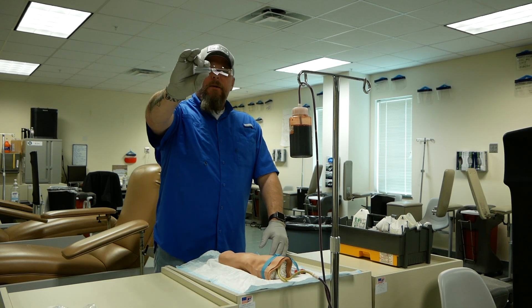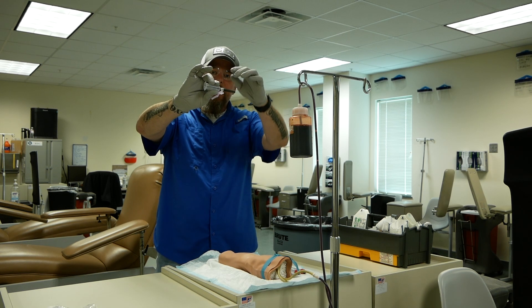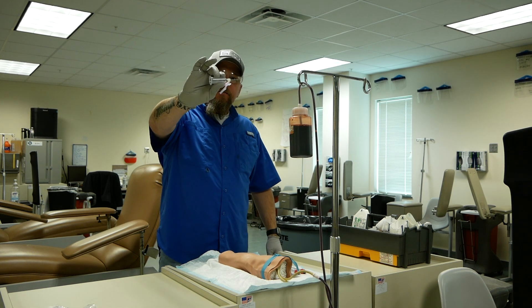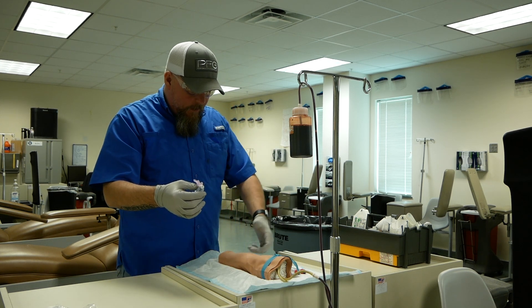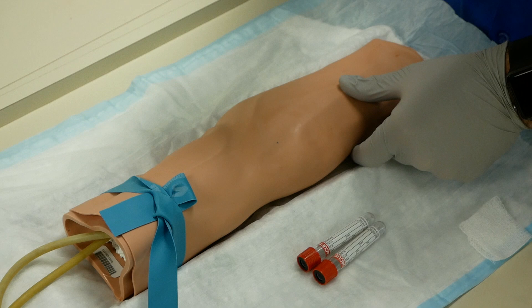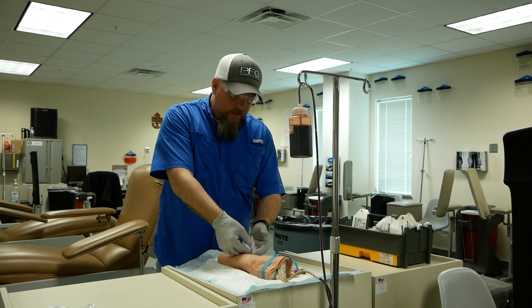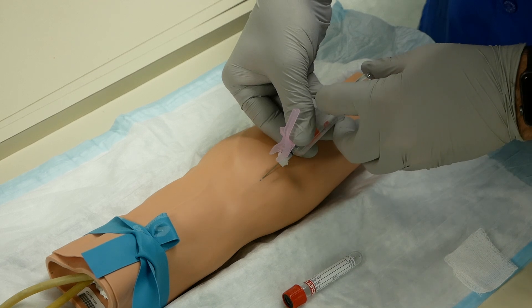Pick up your vacutainer holder with your dominant hand, pink safety cap on the bottom this time. Take your non-dominant hand and pull your pink safety cap back. Once these fingers are in position, they do not move. Pull — not twist — your black cap off. Go from this position to ensure the bevel is facing us, so when we come down the bevel is facing up. Take your non-dominant hand using your thumb, pulling the skin taut about three to four inches below the site. Come in at a 15 to 30 degree angle, going in bevel plus a little bit. Once your needle is in place, stabilize your hand on your patient's arm. Pick up your vacutainer tube, drop it in, and puncture the tube like we're giving a shot.